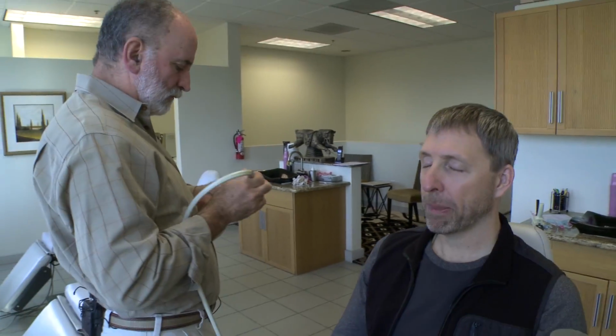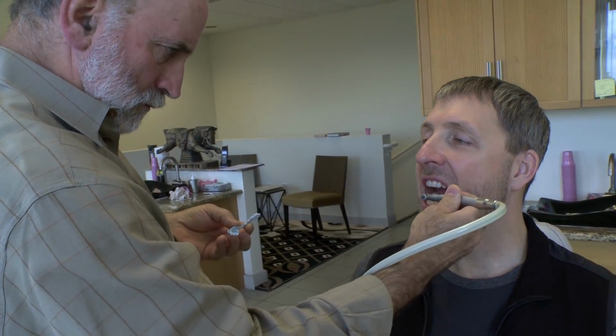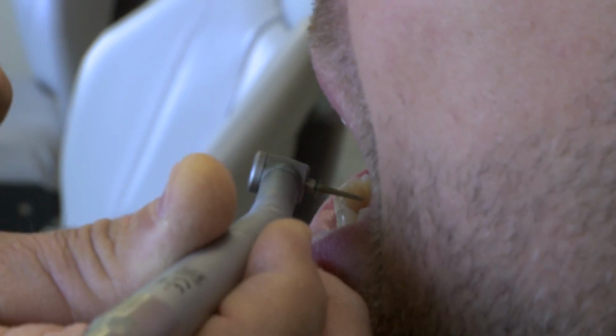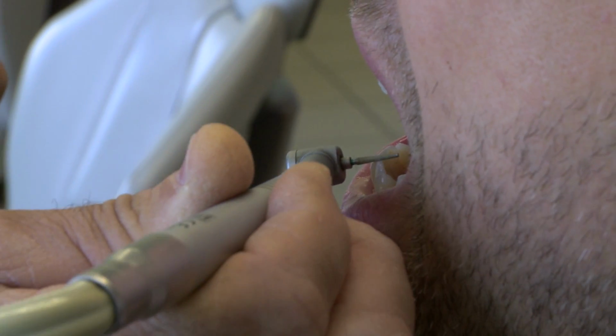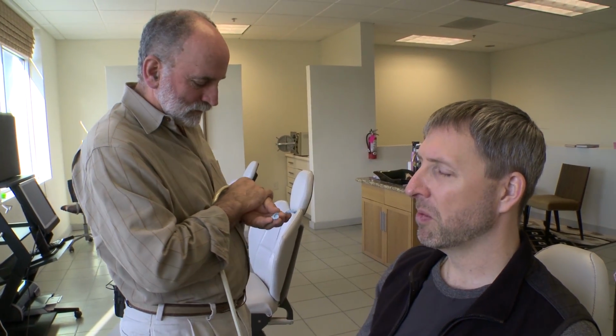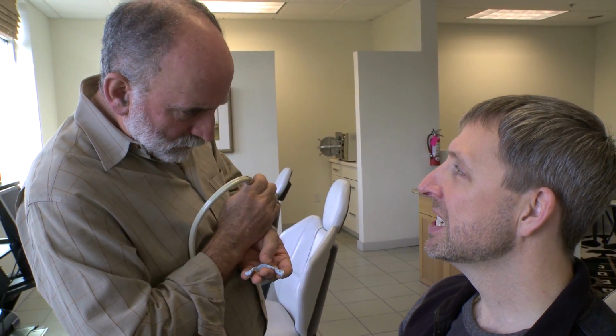Now what touches first? Right here, front left. Okay. Bite, stay closed. See it? Yep. So drilling teeth, in my opinion, is drilling brain tissue. It has about the same importance. Yeah, I'm glad there's no hitting on the left. Now it's all on the right, though. So we need to just bring the height of the front down a little bit more, I think. So now switch back to the right side. See it? Stay closed one more time. Open again.